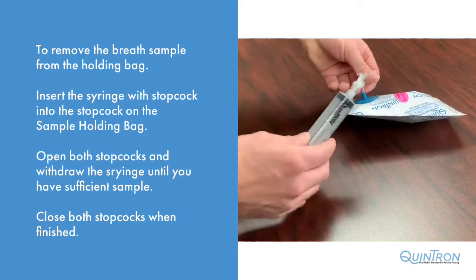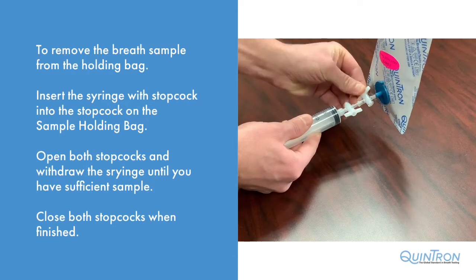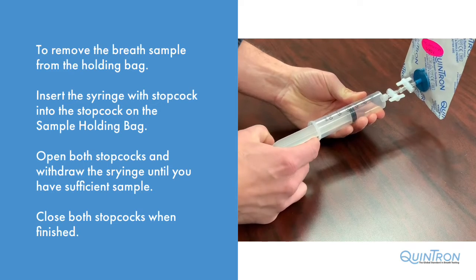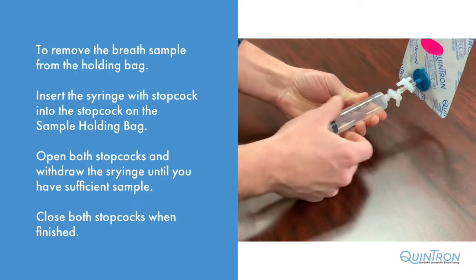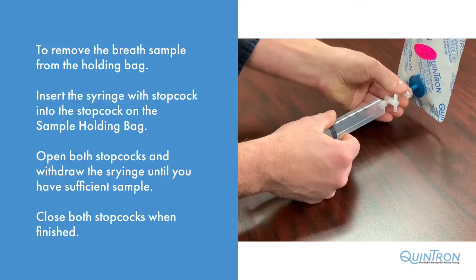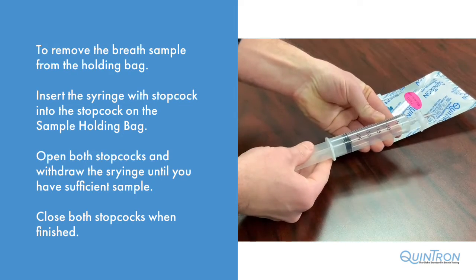To remove the breath sample from the sample holding bag, insert your Quintron syringe into the stopcock on the bag. Open both stopcocks, withdraw your sample, and close both stopcocks. Only remove the syringe with one stopcock off of the bag. Now you're ready to analyze.